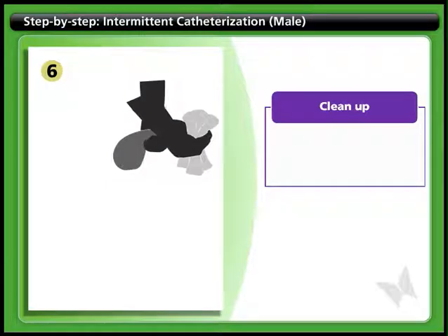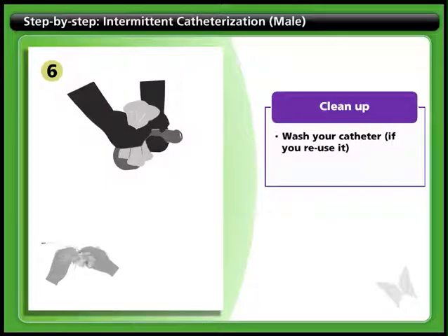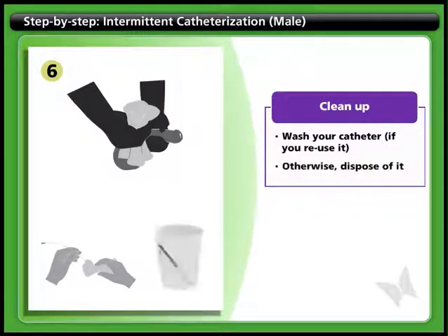Step 6: Clean up. Wipe any excess lubricant off your penis. If you reuse your catheter, wash it with warm soapy water, dry it, and store it. Otherwise, dispose of the catheter, packaging, and any other garbage.